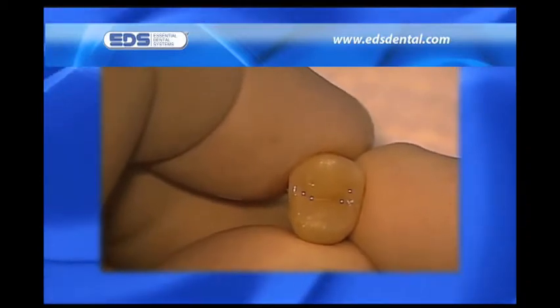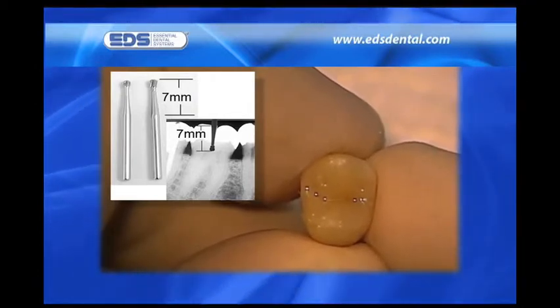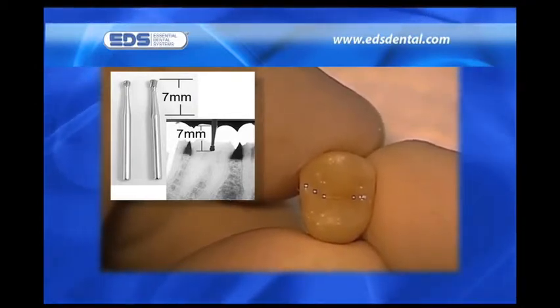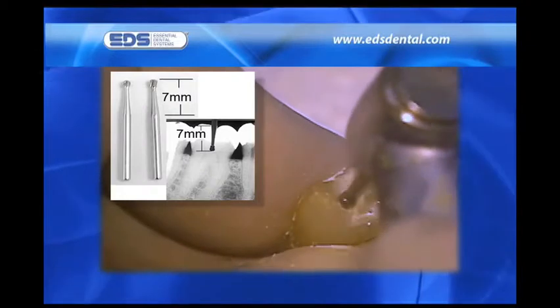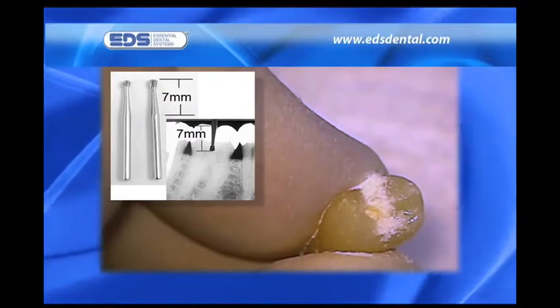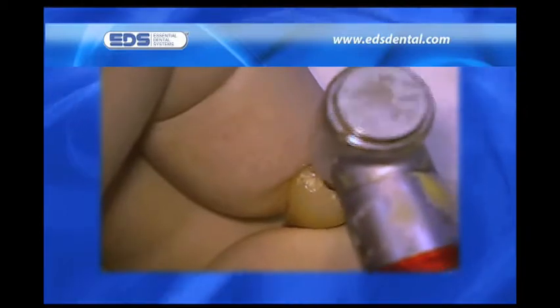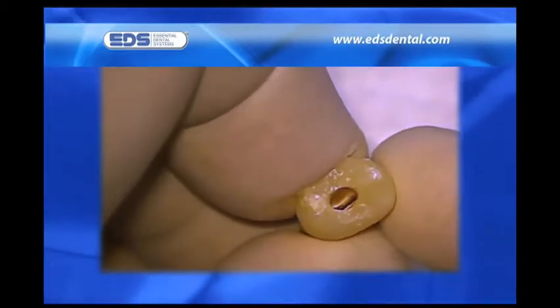Prior to starting our shaping procedure, we must first establish access. This is most often done with a long shank number two or four high-speed surgical round bur. The bur head plus the length of the tapered shank is seven millimeters long before the shank becomes parallel. Seven millimeters is the depth of penetration you want to make into the occlusal surface of all teeth, including molars, provided the occlusal surface has not been drastically worn down. As you can see in our presentation of the extracted bicuspid, a depth cut of seven millimeters allows us to penetrate deep enough to establish contact with the pulp chamber.